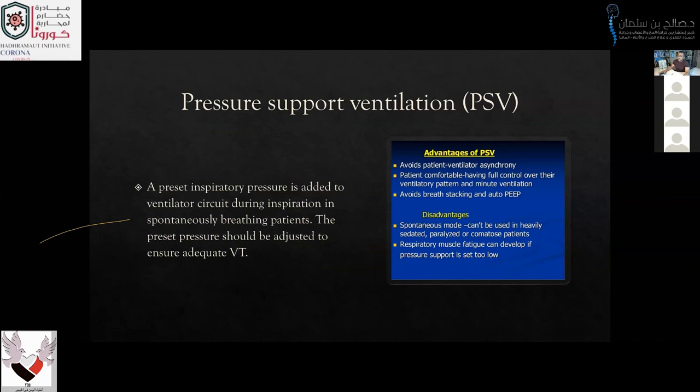Pressure support ventilation: a preset inspiratory pressure is added to the ventilator circuit during inspiration in spontaneously breathing patients. The preset pressure should be adjusted to ensure adequate tidal volume. The advantage is that it avoids patient-ventilator asynchrony as before. The patient is comfortable, having full control over their ventilatory pattern and minute ventilation. It avoids breath stacking and autoPEEP.